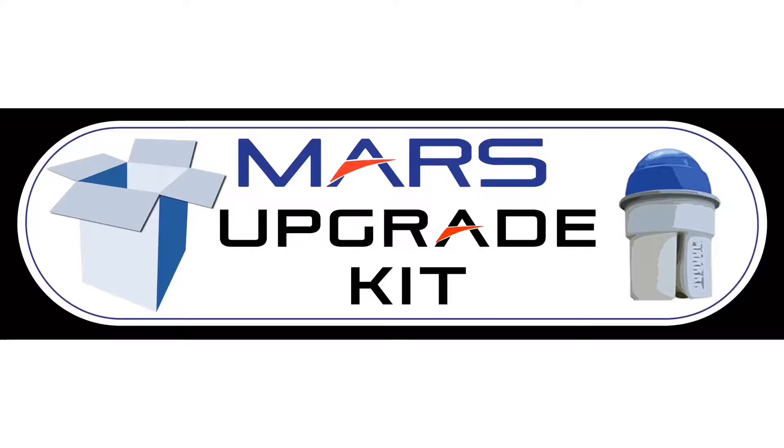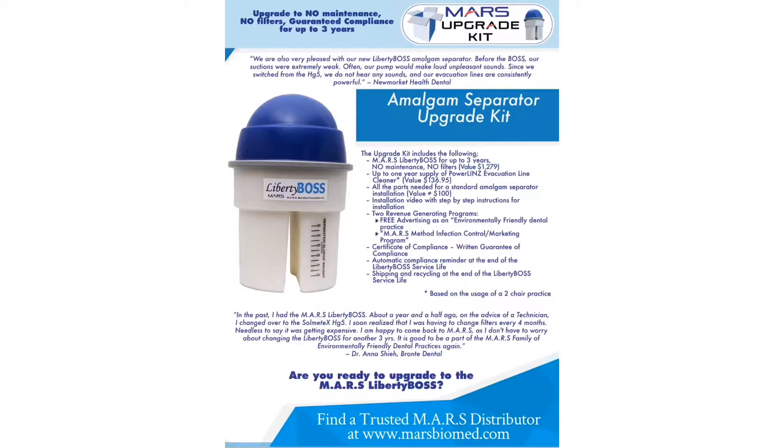Today we'll be reviewing the installation of the Liberty Boss using the wet upgrade kit from Mars Biomed. The Mars upgrade kit supplies everything needed for a dental practice to upgrade their office to a Liberty Boss.